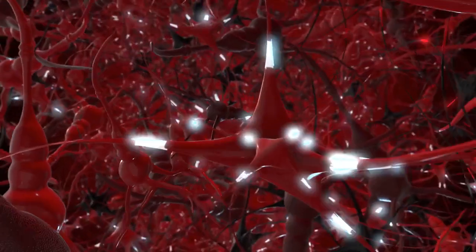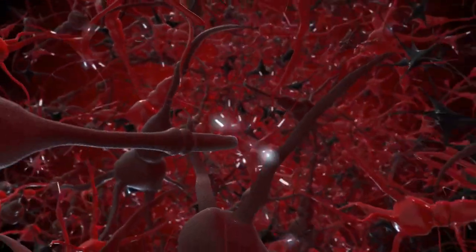So if I stimulate the nerve, it's going to send an electrical signal that is exactly like that, of a waveform, and how tall or high that wave is reflects the health of the nerve cells that make up that nerve, or the health of the axons. So the more axons you have, the taller the action potential. The fewer axons you have, the smaller the action potential, the smaller the wave.